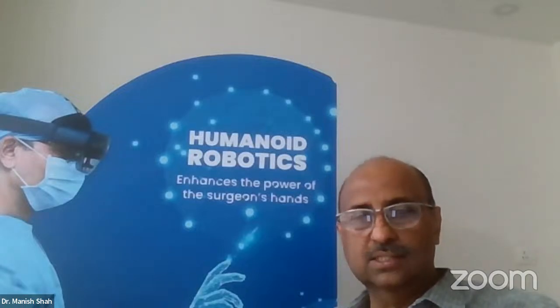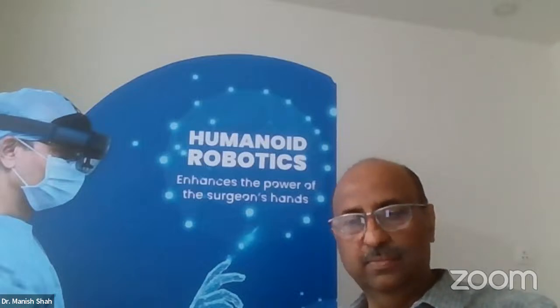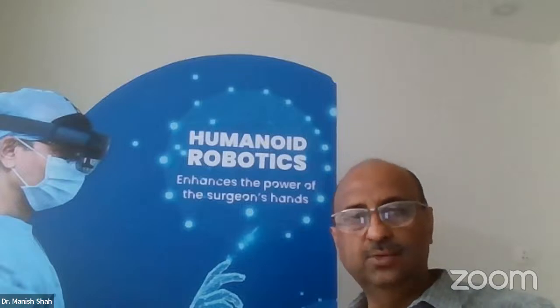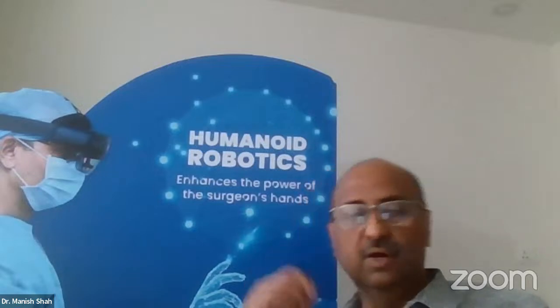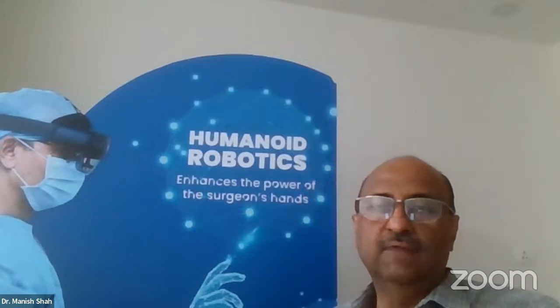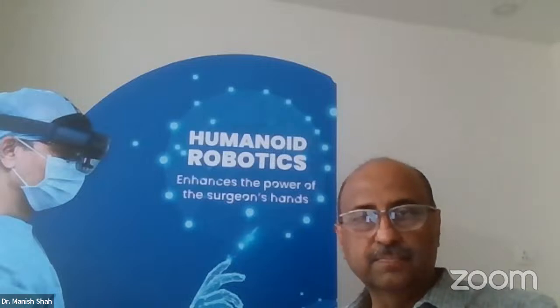I'll aim to use a slightly more constrained implant, rather than going with a pure CR, I might use a PS knee. And then, based on the amount of deformity that remains, I will always check my extension gap before proceeding to taking the AP and chamfer cuts in these cases.